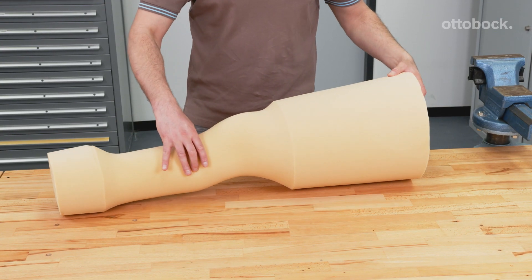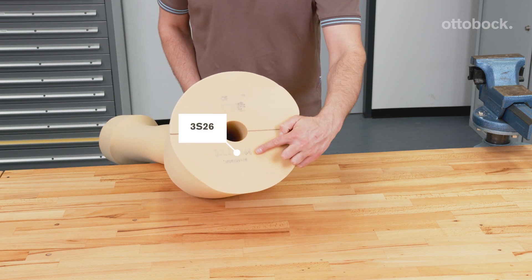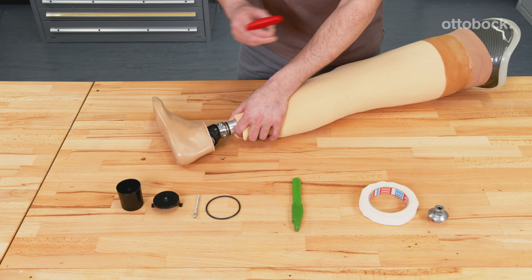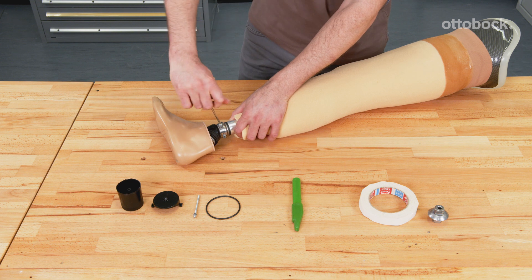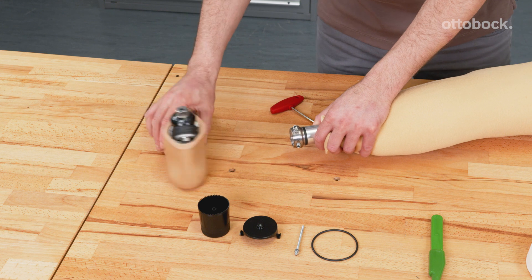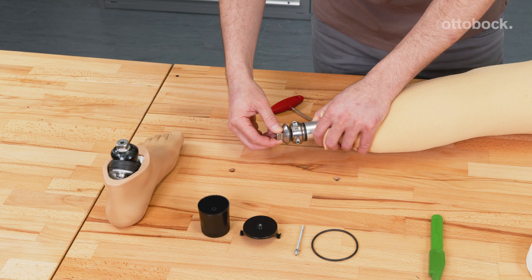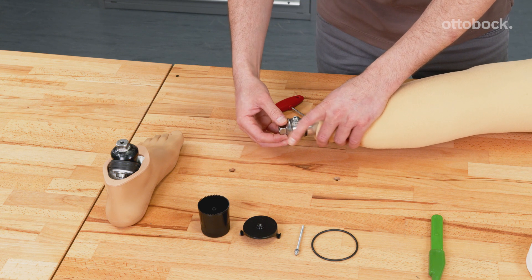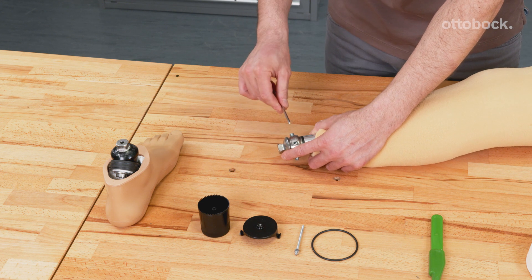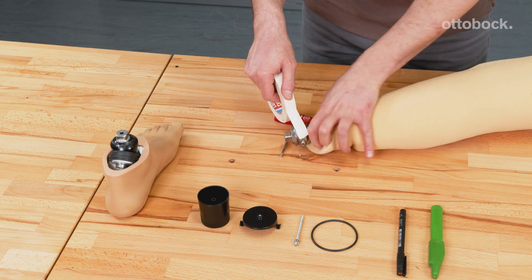The Konevo knee joint is now compatible with a cosmetic foam cover. Grind the foam cover according to the dimension of your user. Dismount the prosthetic foot, taking care that the foot position does not change. Mount a pyramid adapter temporarily that fits through the distal hole of the foam cover. Protruding screws can be covered with tape to avoid ruptures in the foam cover when removing it.